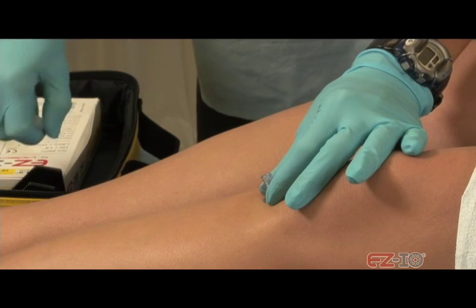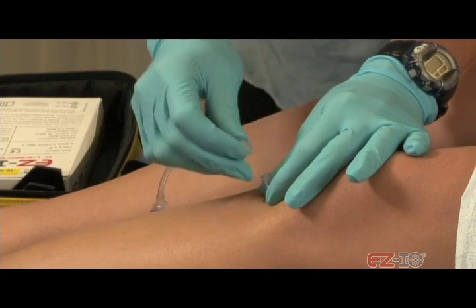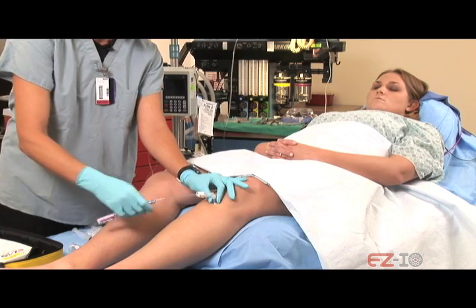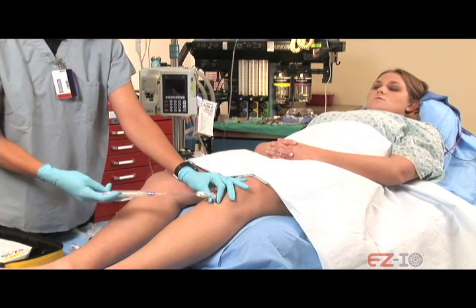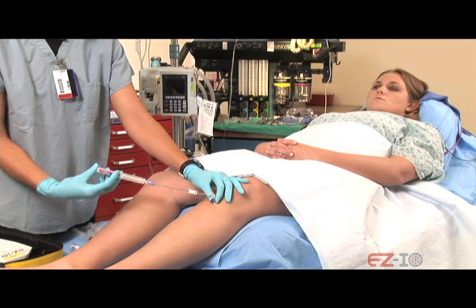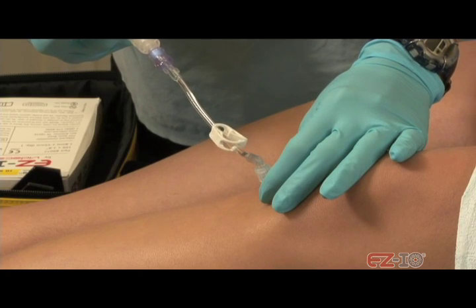This is the medication. It's going to make it numb, okay? So it's going to make it numb in there. As I'm putting it in, if I'm going too fast, if there's too much pain, let me know and I'll just slow down, okay? Here we go. Let me know if I'm going too fast. How are you doing? Fine. On a scale of 1 to 10, what's your pain? 2. Okay.